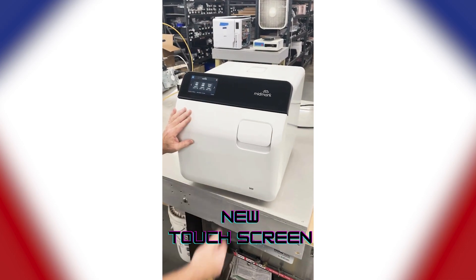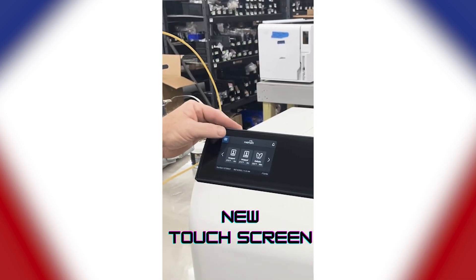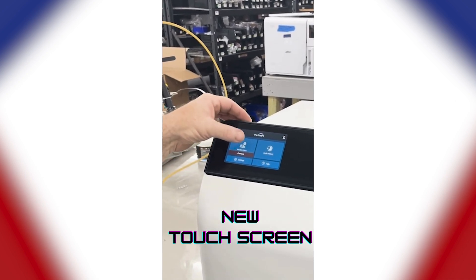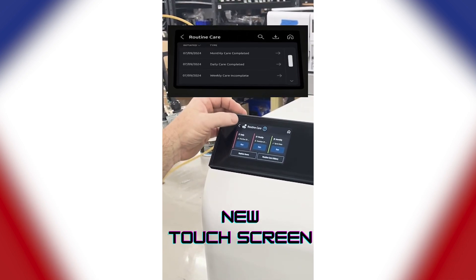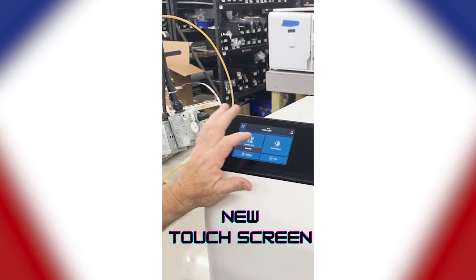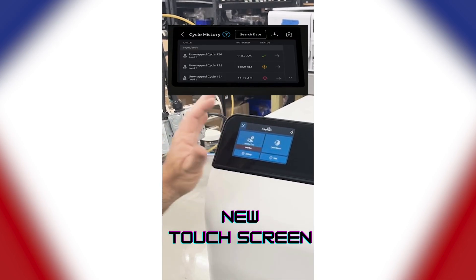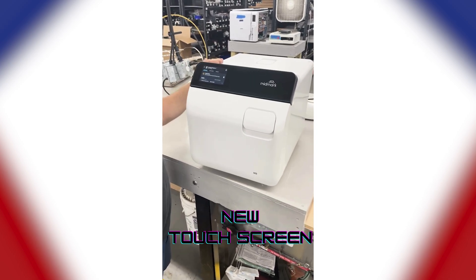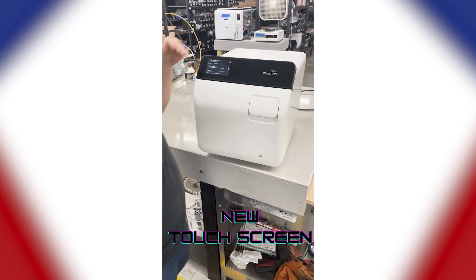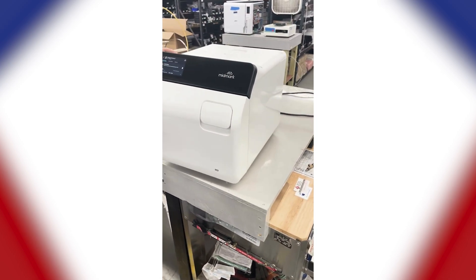They've got a touchscreen now, and as you can see, we can go in there and it's going to tell you your routine care. It's going to hold all your cycle counts, your whole cycle history, so there is no need for a printer now or data logger. Everything is going to be stored internally. You do have the option back there for a USB.